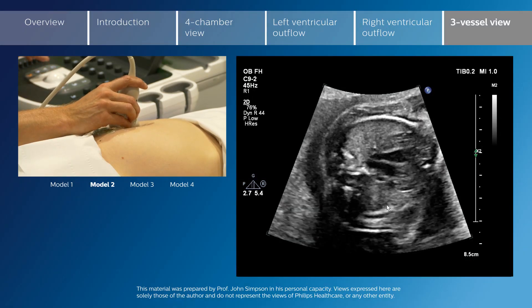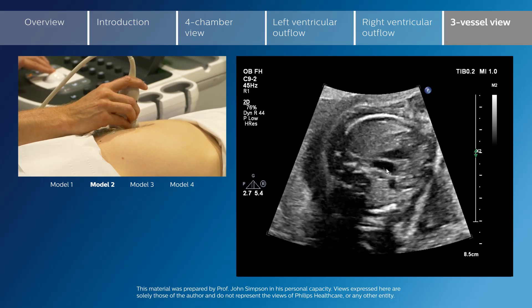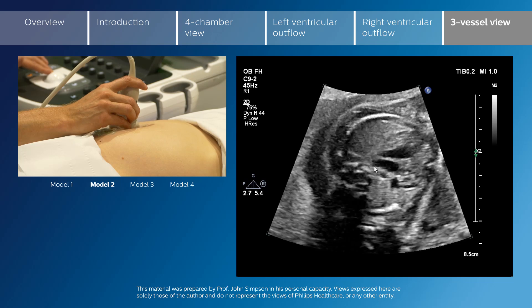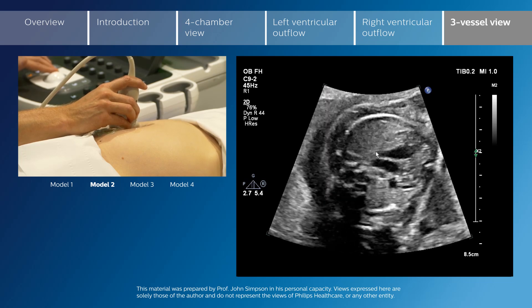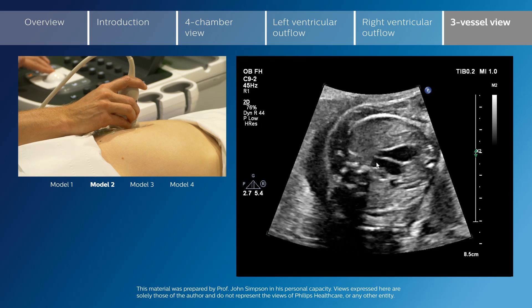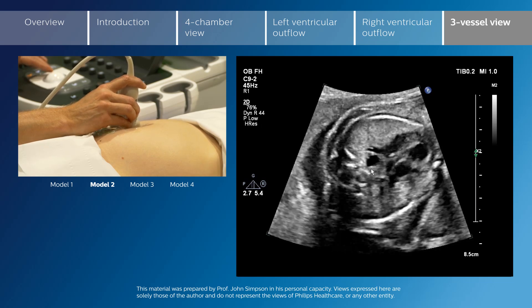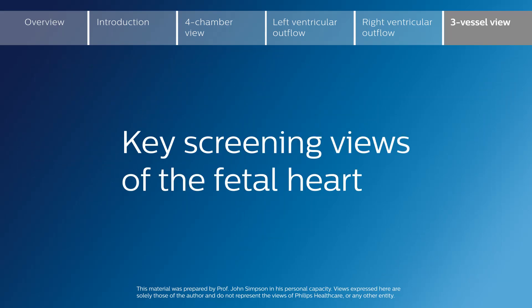This constitutes a normal three vessel view, with similar size of the transverse aortic arch, isthmus, and the ductal arch. There should be no major discrepancy in the size of those structures. These represent the key core screening views of the fetal heart which we will be discussing.